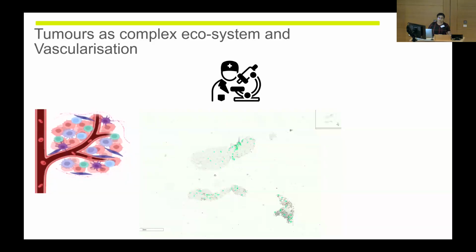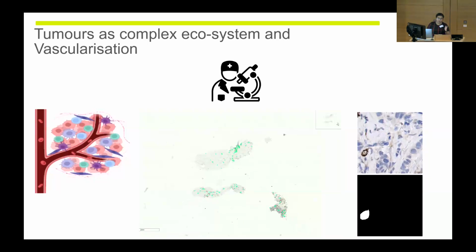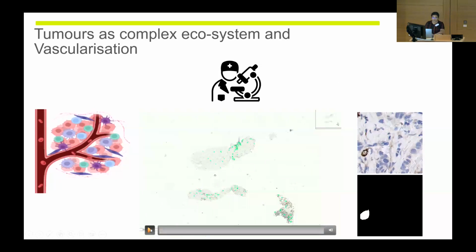We give the slides to the pathologist, who is Emily Jury, a PhD student in our lab. We effectively collaborate with them, because it's very important that you get the knowledge of the blood vessels, because within any histology section there could be a dead section of the tumor, called necrosis. You have to avoid these as well when you're collecting the annotations. That is going to be the pool of training data that goes into your training regime.